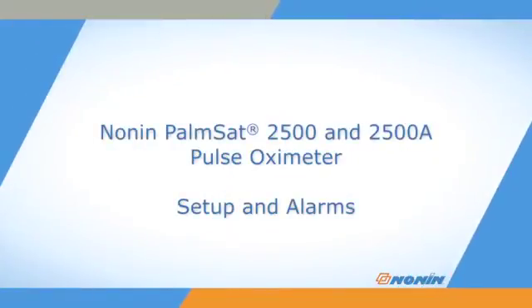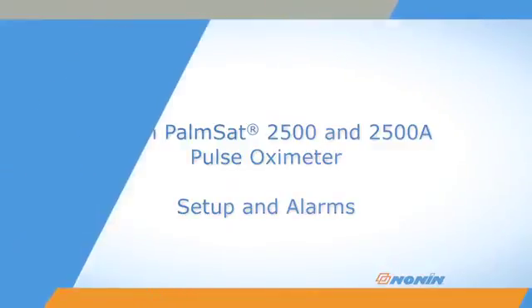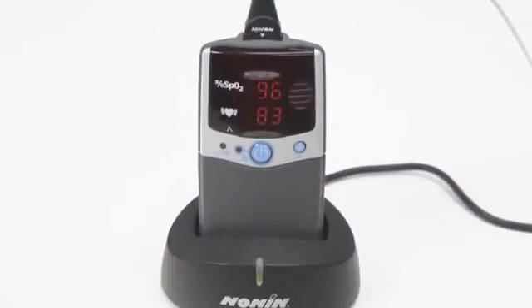This short video shows how to set up and adjust settings on Nonin PalmSat model 2500 and 2500A pulse oximeters.